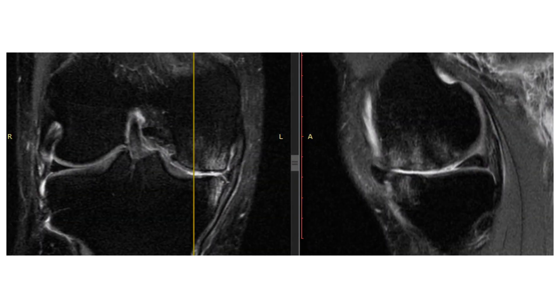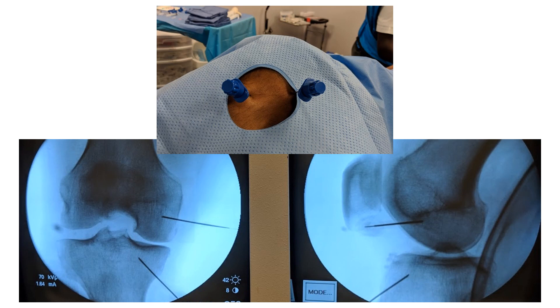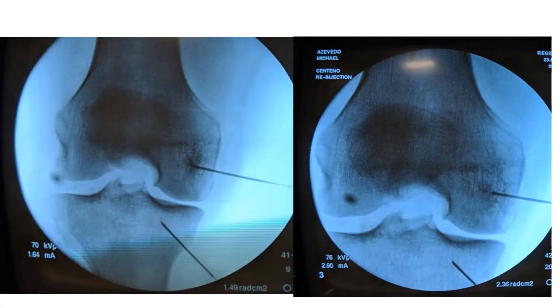This is a patient I saw this week who has bone marrow lesions — these white areas right here and right here, just underneath the joint. On the sagittal view, they're here and here. I want to target those specific spots, and you can see I have two microtrochars placed to try to target those very specific areas. I'm going to show you a series of contrast injections — I see this every day; over this two-week period I'll probably do 10 of these bone injections. You can see there's a little bit of contrast right there, and as I inject a little more, the contrast goes right here. The problem is my lesions are kind of down here, so I'd like to get material to flow down there.